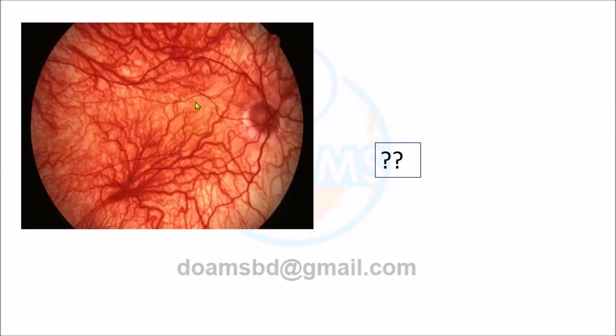So in the retina, you see that there is no pigment, and it has been like this from birth. What could it be? You see the optic disc, and the vessels are coming from there. You are seeing too many vessels. The reason is that there is no blackening. In a normal retina, there is a blackening pigment layer. You can remember that one layer of the retina is the pigment layer. As the pigment layer is there, you do not see too many vessels, capillaries and arterioles, only a few, 8 or 10 vessels. But here, all the vessels are visible. It is not that there are excessive vessels, but technically the vessels are visible because the background is white. No pigment is there. What is the condition now?